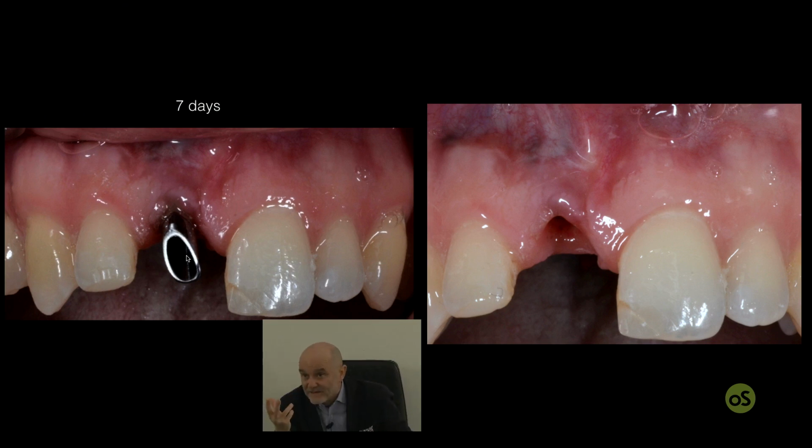not gray, not metallic. But most of the time, especially when the implant is very buccally displaced, the technicians tell you that if you want an abutment in zirconium, he has to leave much more thickness of material, to prevent risk of fracture during the healing, because this abutment must last for about 6 months before being changed.